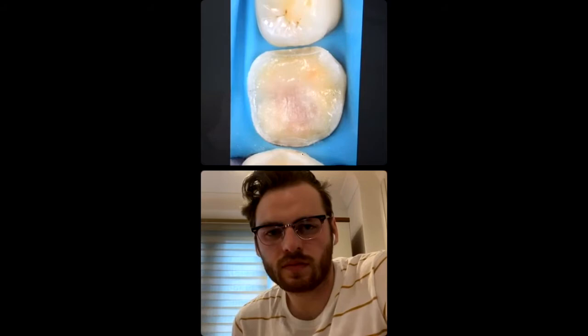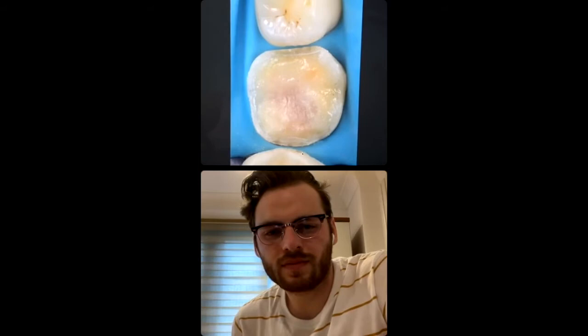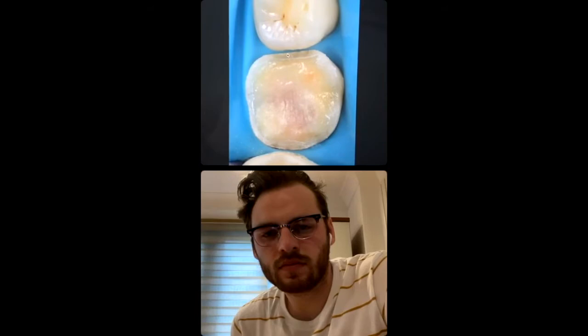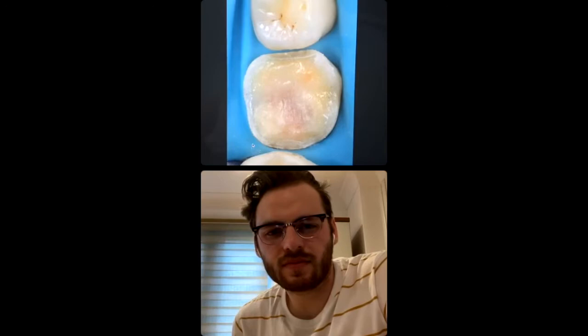On the larger crack here, I've put some APX into the crack, then done a small square of Ribond packed in, and then a larger bit — this is to stitch this crack area back together. Then I've put a larger bit of Ribond over the area with decay, to help protect our dentine bonds. Then I've gone over the top with flowable composite — just to seal it up because sometimes these areas can be a little bit rough, and if you're taking a scanner impression it doesn't look so nice. So just smooth it over with a little bit of flowable composite. Then re-prep the margin — I use a fine red straight burr without any water and just go around to tidy everything up. My favourite instrument, which I think everyone should use, is a hand scaler. I always go around the margins and just chip off any little bits of enamel, so it's all super clean. Then scan and done.